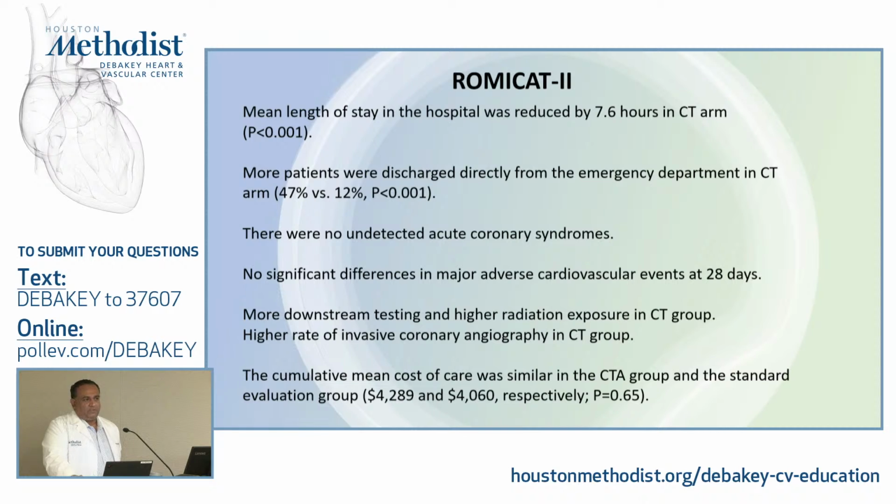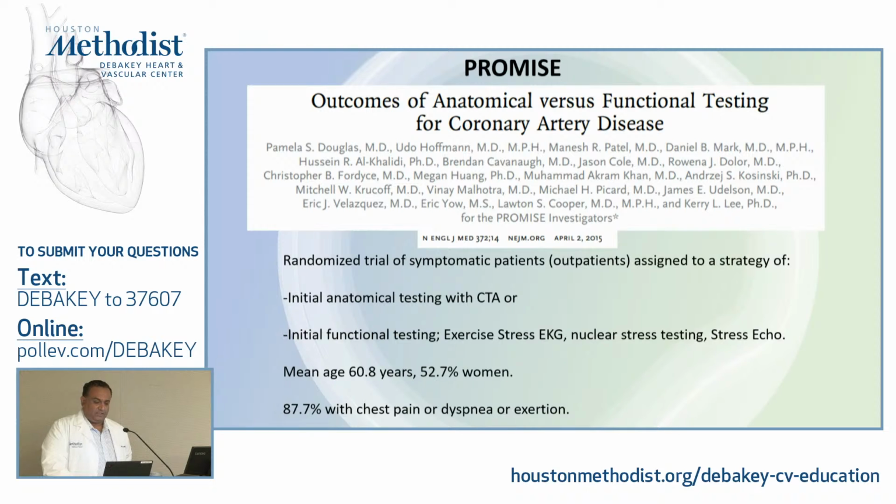And when we talk about the SCOT-HEART trial, I'll show you the data. It's actually fairly common to see an increase in coronary angiography and revascularization with cardiac CT in the initial few months. But if you look at long-term after years, it probably is not any greater than doing the functional imaging strategy. The cumulative mean cost of care was similar in both groups. So performing CT, at least in this study, did not really lead to any cost savings.